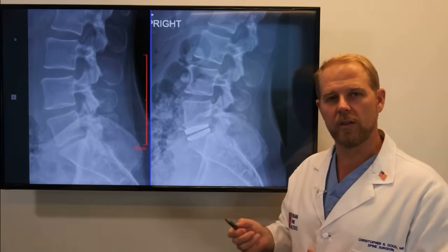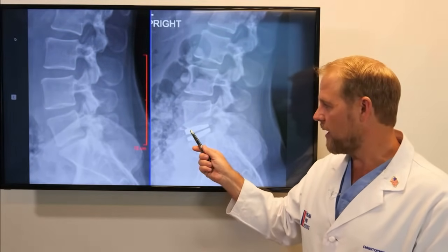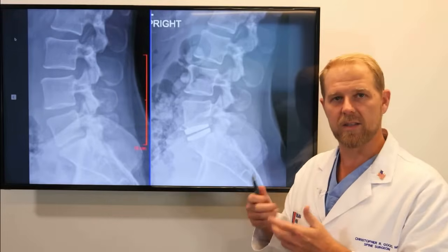This is a single level lumbar disc replacement, and we can see this is the Oreo — metal on top, plastic in the middle — and that allows movement as the patient bends and twists and lives their life.